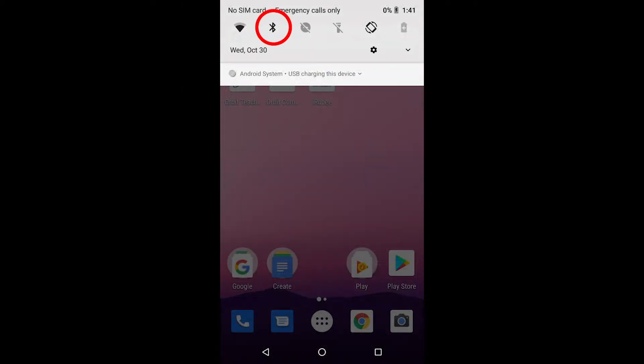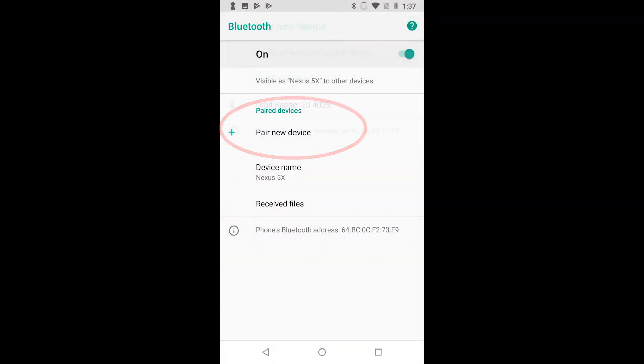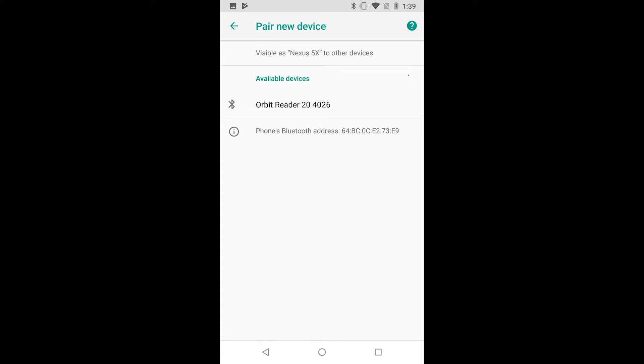On your Android device, turn on Bluetooth. Search for the device to pair with, and then once the Orbit Reader 20 serial number appears, select it and pair.